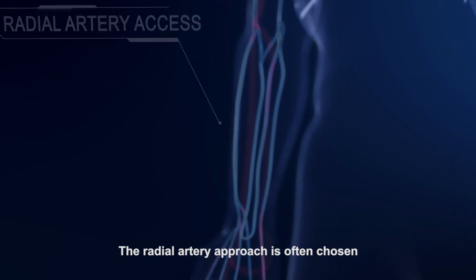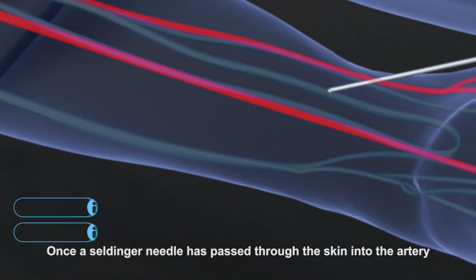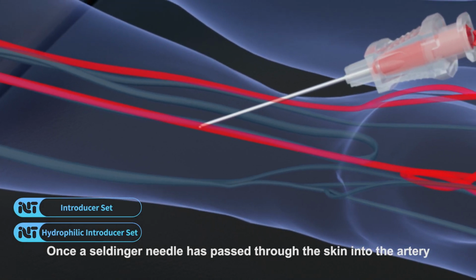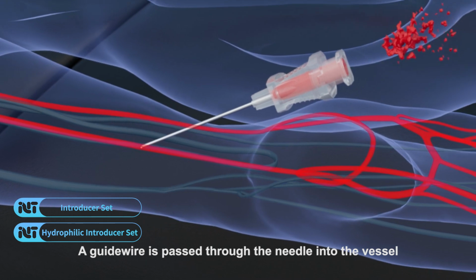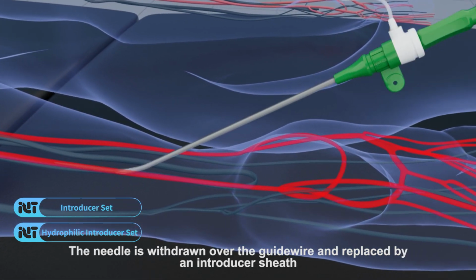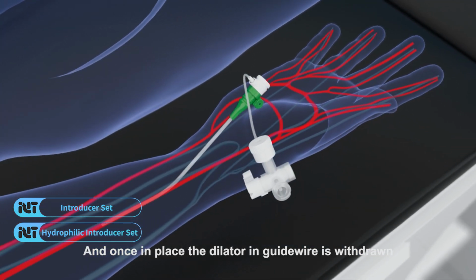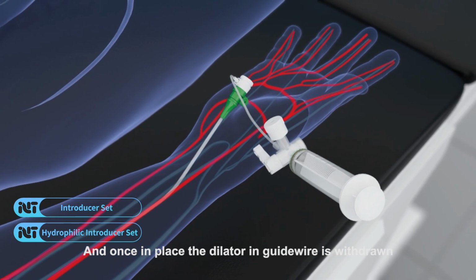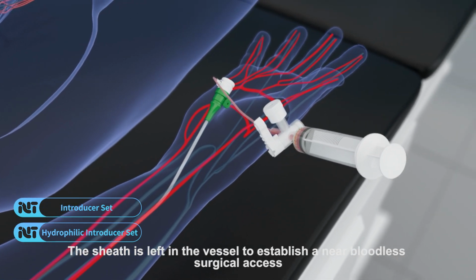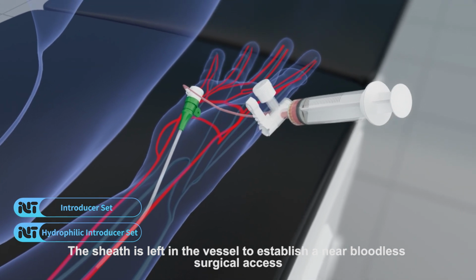The radial artery approach is often chosen. Once a Seldinger needle has passed through the skin into the artery, a guide wire is passed through the needle into the vessel. The needle is withdrawn over the guide wire and replaced by an introducer sheath, and once in place the dilator and guide wire are withdrawn. The sheath is left in the vessel to establish a near bloodless surgical access.